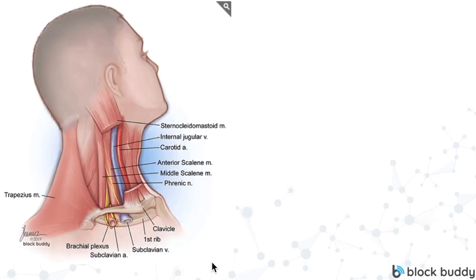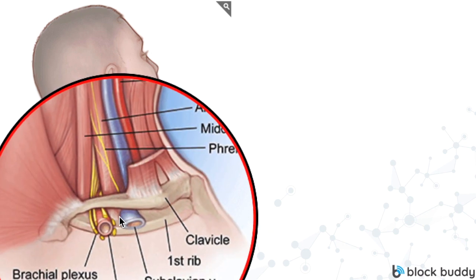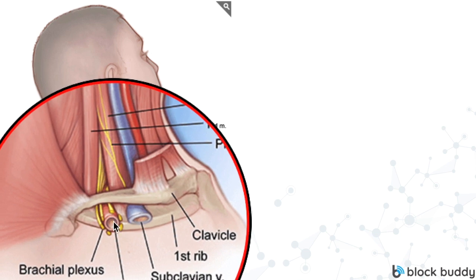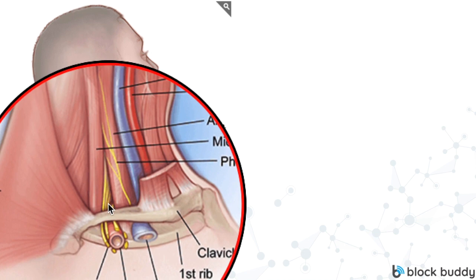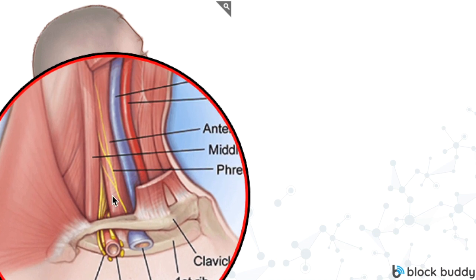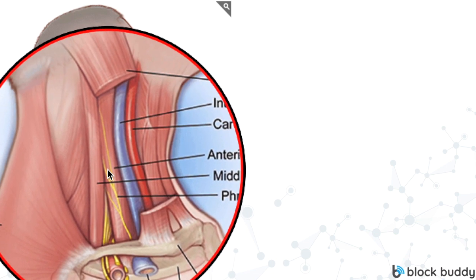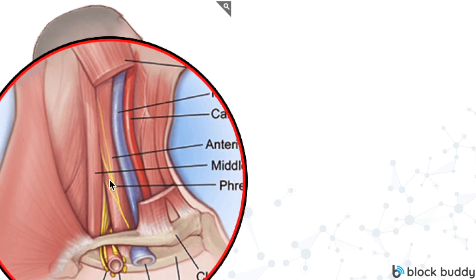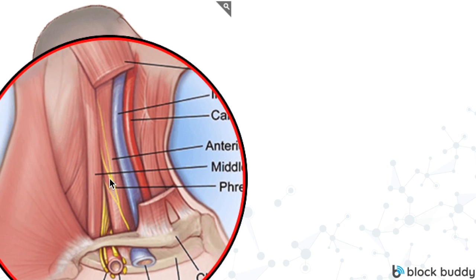Let's review the anatomy from the BlockBuddy Pro drawing. Just below the clavicle we have the subclavian artery, and as we go above the clavicle, the nerves of the brachial plexus are superior and lateral to the subclavian artery. As we slide up the neck, we're going to see those nerves come together in what looks like a snowman or a stoplight. Also notice the phrenic nerve, how it passes over that anterior scalene muscle and moves away from the brachial plexus as we travel down the neck.